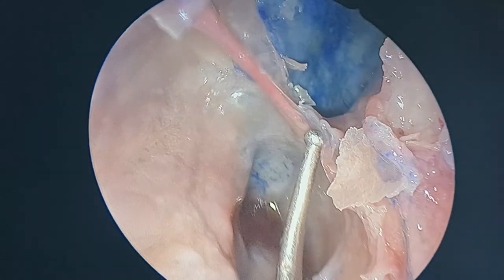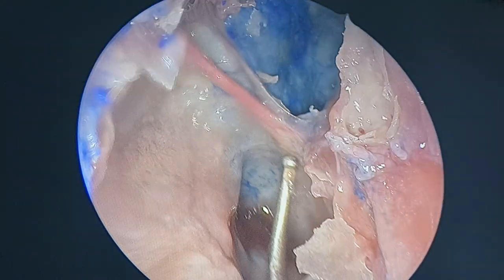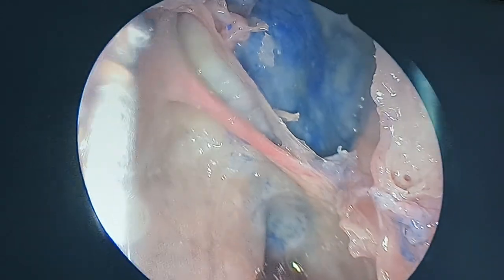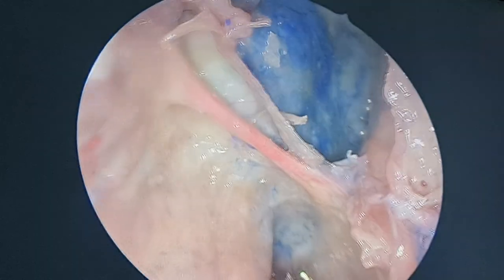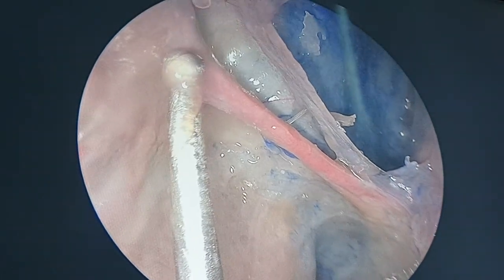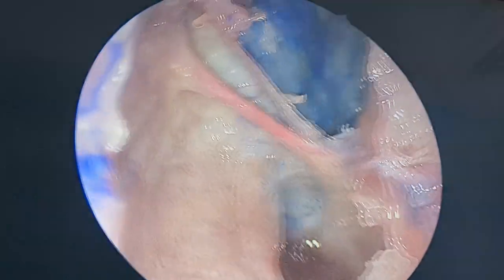Now this artery is there. See, this is traversing, coming from the orbit, going obliquely in the roof, and entering into the lateral lamella. Sir, you are asking about the lateral lamella. Here is the lateral lamella. A slightest kick, slightest hit, and the CSF will come.